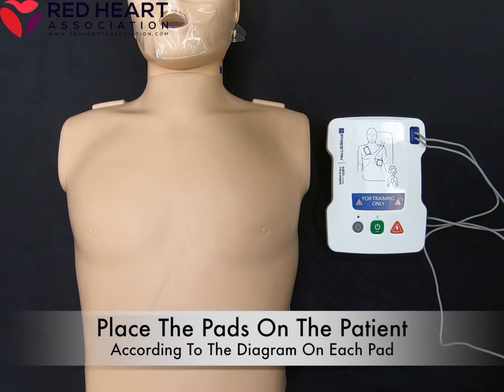Now, place the pads on the patient according to the diagram on each pad.